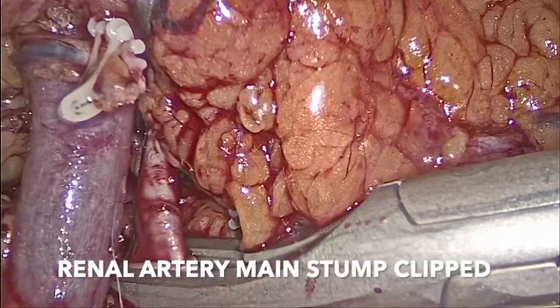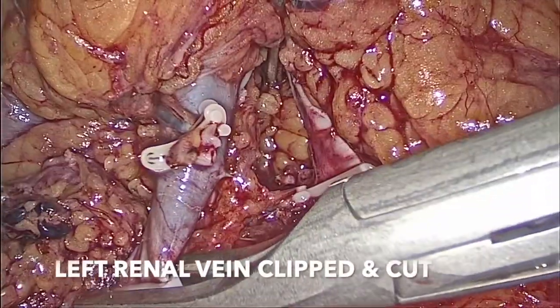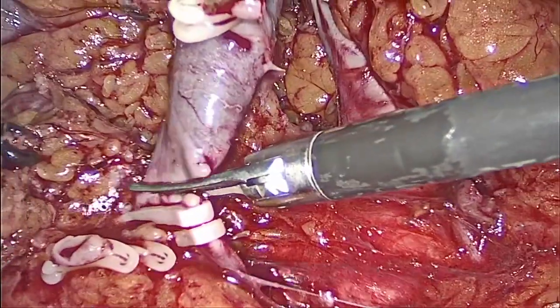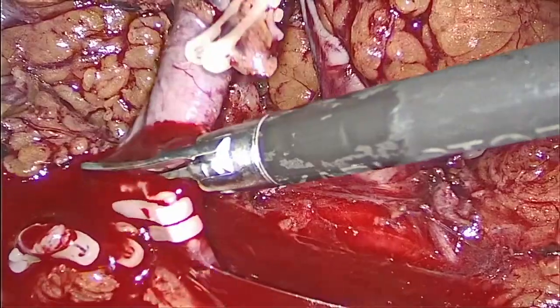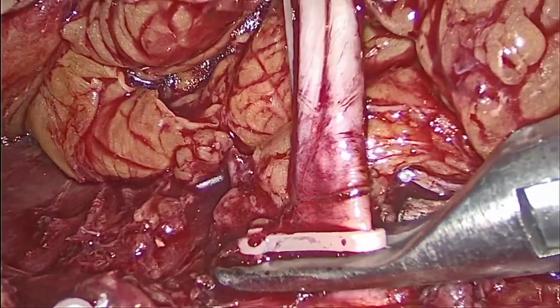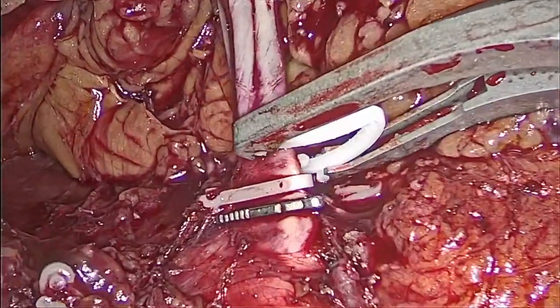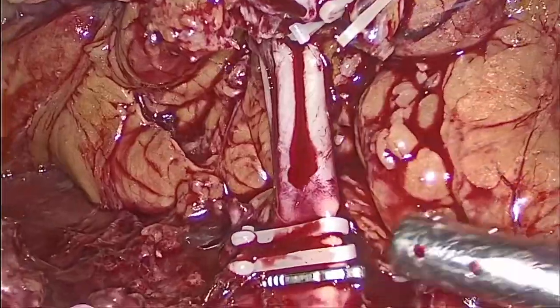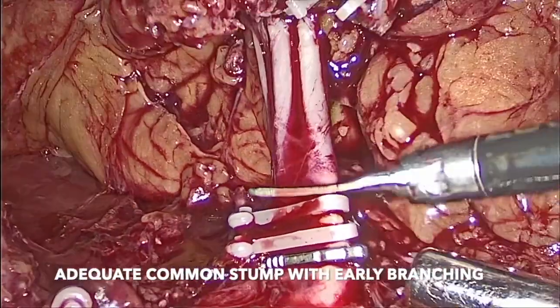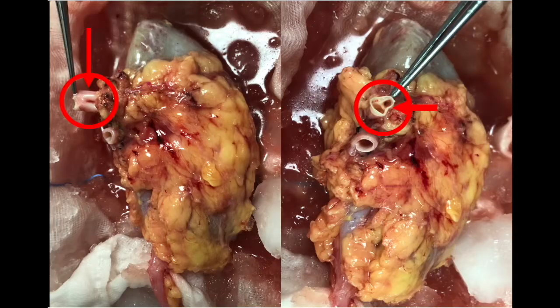Renal artery is clipped as low as possible first, and the vein is doubly clipped and cut. This provides additional length for application of clips, and it is safer to apply a metal clip as we cut the artery flush to the distal clip. This image shows the common stump achieved for anastomosis as a single vessel.